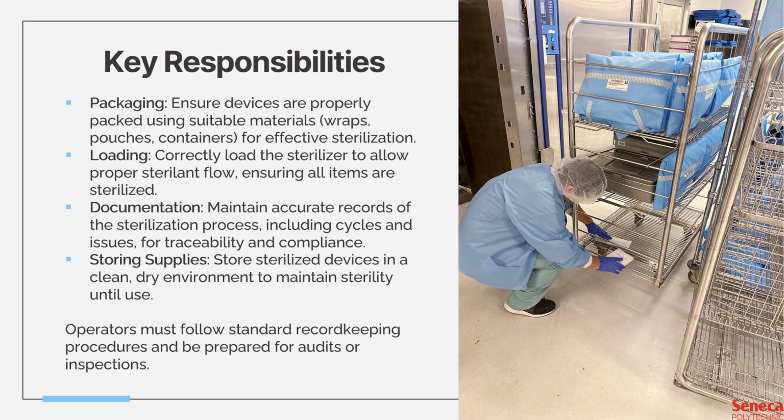I would say avoid having wrapped instruments like this be so close to metal, because metal does gather condensation due to its density and material. So if the sterilant were to get trapped here, condensation would be trapped here, and then obviously this would become soaked. And then this part too, they're laying it kind of leaning towards the back here. This should be leaning forward, assuming that this was wrapped properly. So basically, a lot of these trays are wrapped in here. And if you can imagine, some trays have a lip where it could trap condensation or moisture. So it's important to lay trays forward.